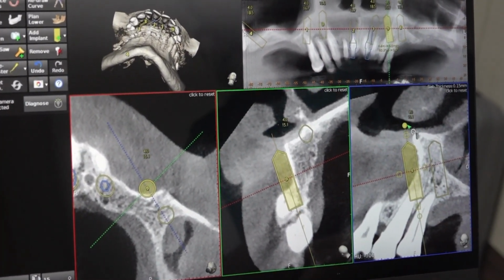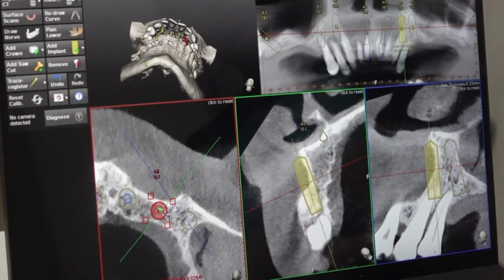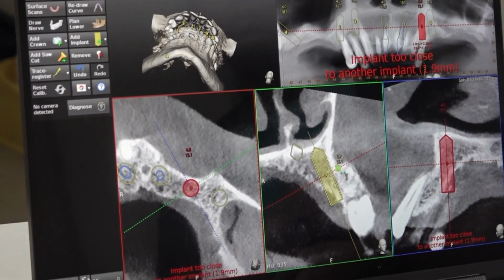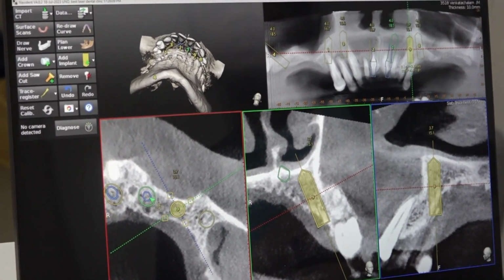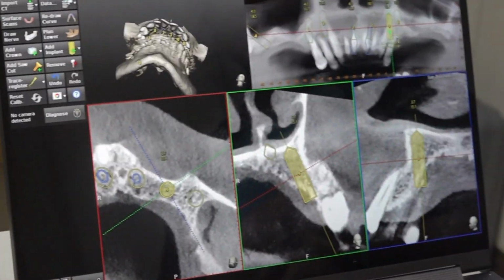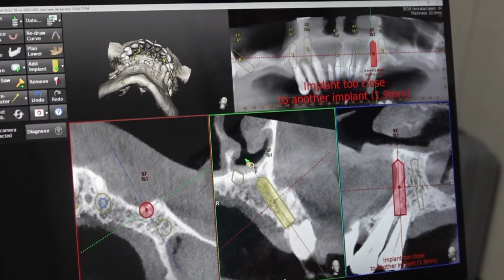Now we have to park, it is similar to car parking. We have to park our car without hitting the nerve. We can actually park from the first premolar.